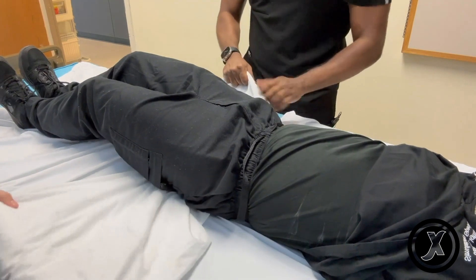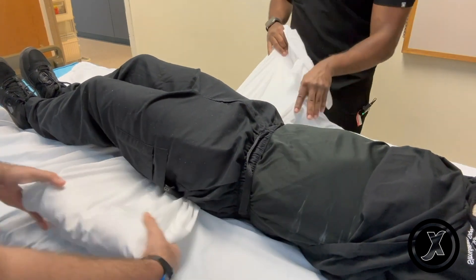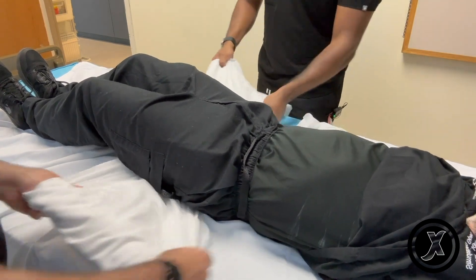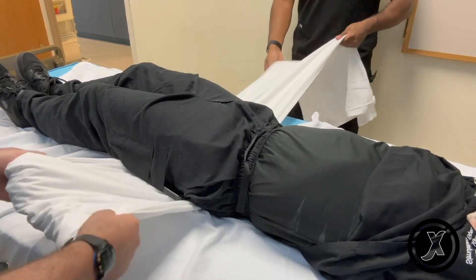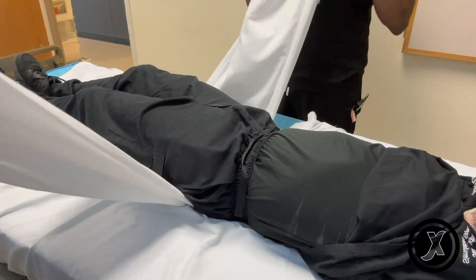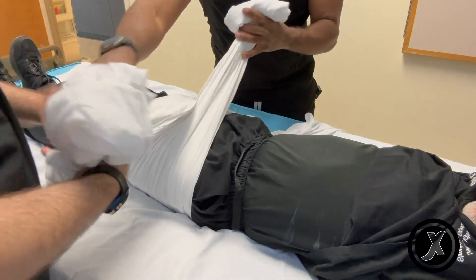Then me and my partner are going to try to align the sheets together so that we can correctly place it around the greater trochanter. And then you have enough bite there. Now we're going to swap spots — crisscross the sheet.